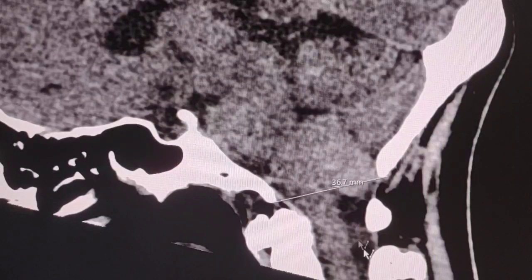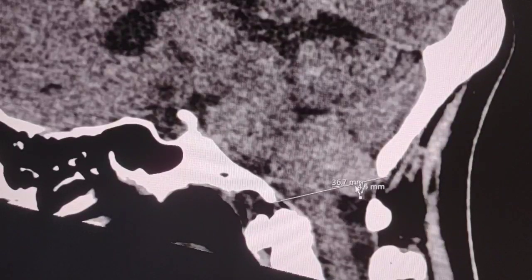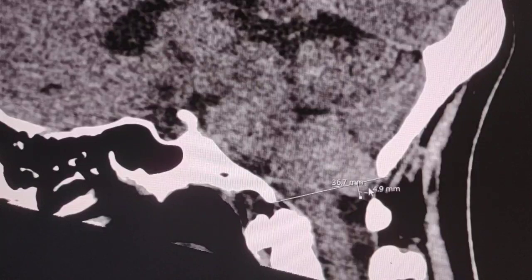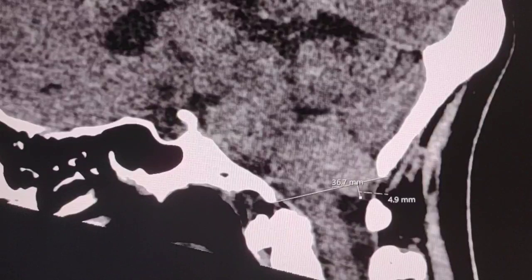Then we measure the lowest part of one of the cerebellar tonsils and here it is. It shows 4.9 mm.